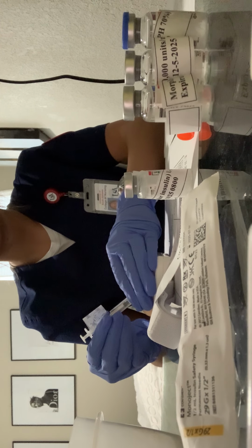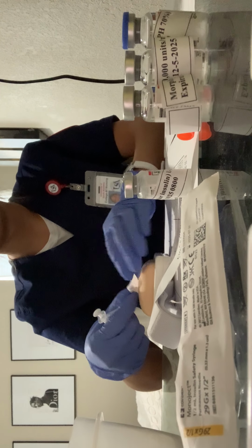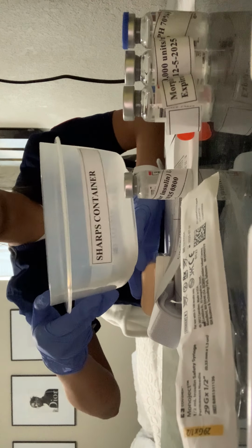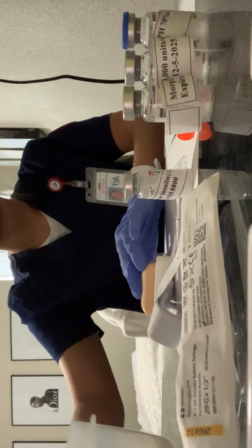All right. And let me get a pad for you. And I'm immediately disposing my needle and syringe into the sharps container.